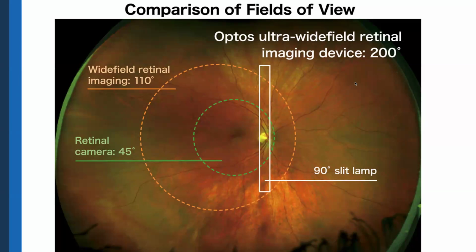So 'di ba usually sabi with two images you can have a nice field of the retina. But the Optos one, yung Optos yan yung medyo, shall I say, the standard ngayon. No financial interest, but medyo siya yung pinakamalawak na na-image at this time.